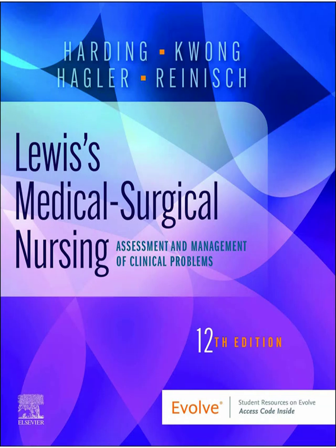This is for patients at high risk of sudden cardiac death. Maybe they've already survived a cardiac arrest due to VT or VF, or they have conditions that put them at high risk. What does it do? It constantly monitors the heart rhythm. If it detects a life-threatening rhythm like VT or VF, it can deliver a low-energy shock internally to try and stop it. Much lower energy than an external defibrillator, usually 25 joules or less.